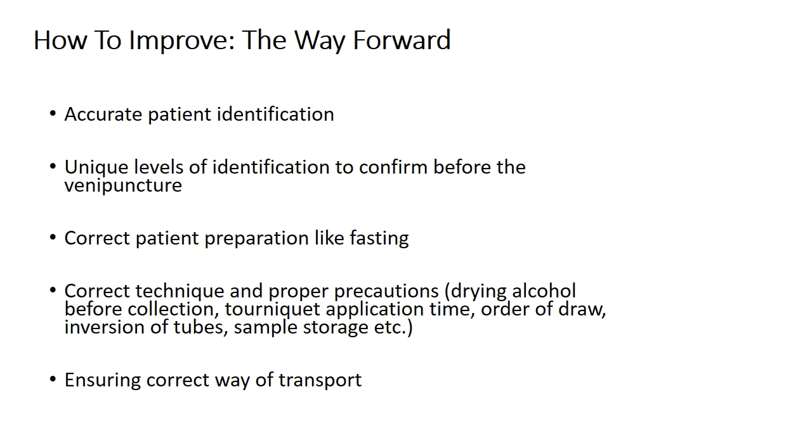I have seen many phlebotomists write the name after collection. That is wrong. This is a wrong practice because they should write the name beforehand. Then they collect the sample after showing the same to the patient, to avoid any mistake of wrong collection or mislabeling. Correct patient preparation, like fasting, etc.